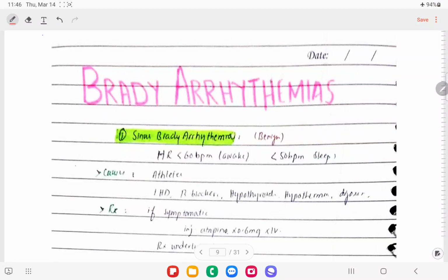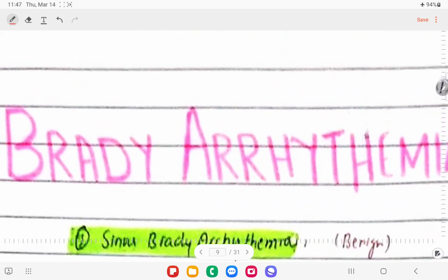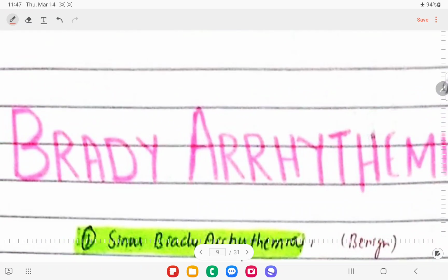Bismillahirrahmanirrahim. So today I'm going to talk about the approach to arrhythmias. First we're going to talk about the bradyarrhythmias. Let me show you how we're going to approach the arrhythmias.